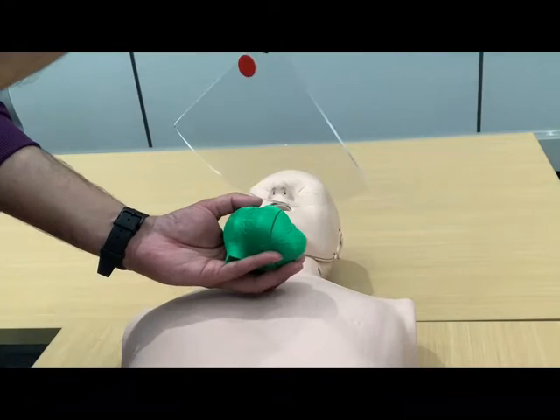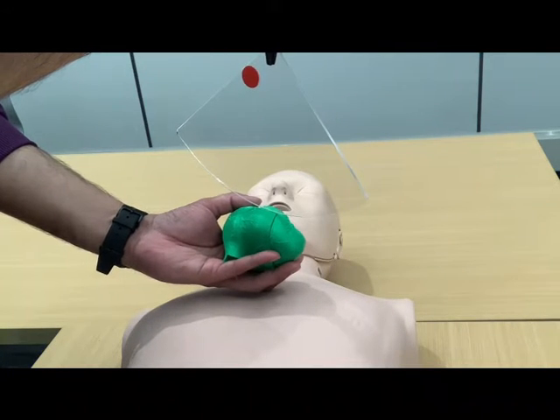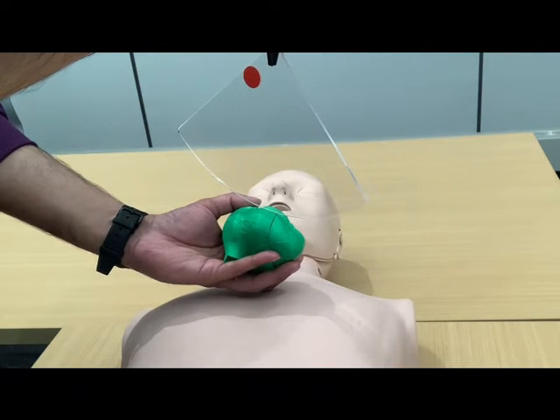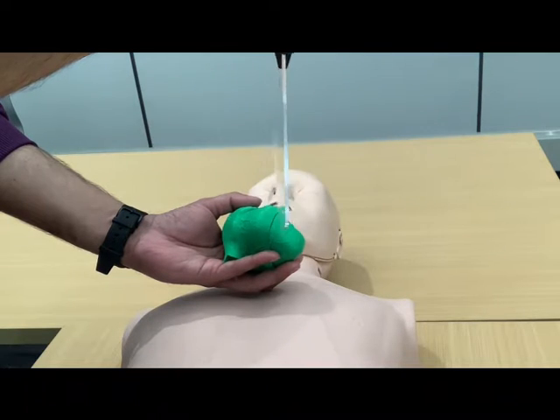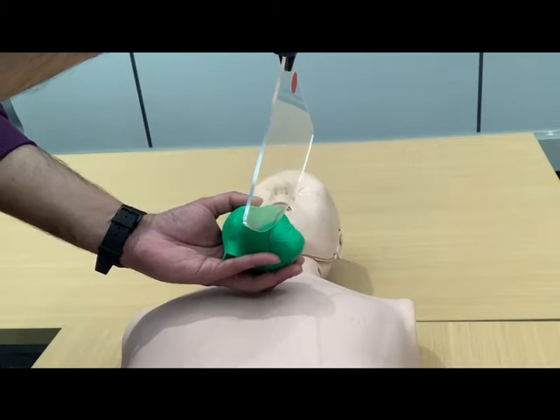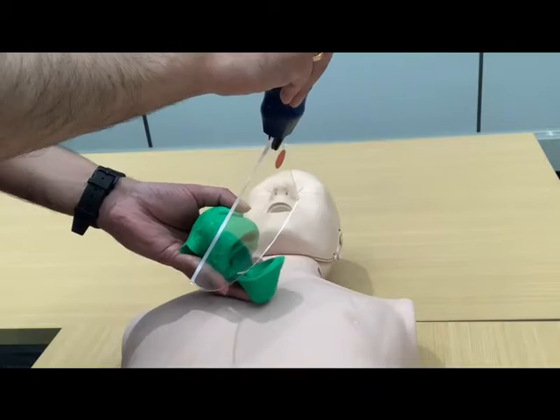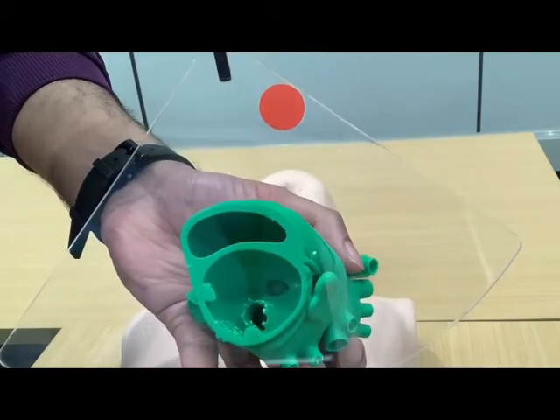To get a long axis view of the heart, your beam was aligned obliquely with the orientation marker towards the patient's right shoulder. Now, if you want to slice the heart in its short axis, you rotate the transducer clockwise such that the orientation marker is towards the patient's left shoulder, and the beam still goes from anterior to posterior. You cut the heart like this and will see an image similar to this.